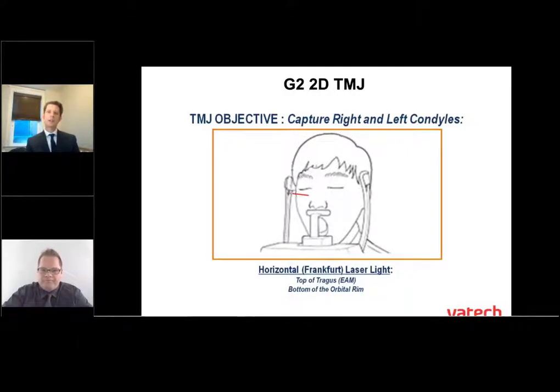And Paul, if you can, let's go ahead and demo that appliance there. If you can get the short chin rest and the TMJ appliance. Right here. Yeah, so go put that in. You'll see how it does stop. And then Paul's going to go ahead and put that right to the base of his nose. Patient would still be in the machine, and note where his chin is. He's not resting on the chin rest. So he's going to articulate open past that. So go ahead and open.